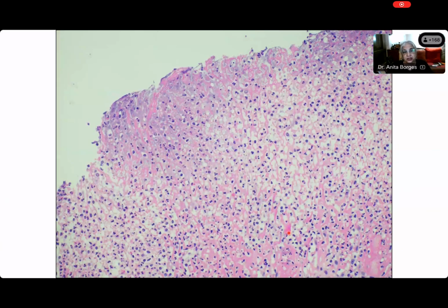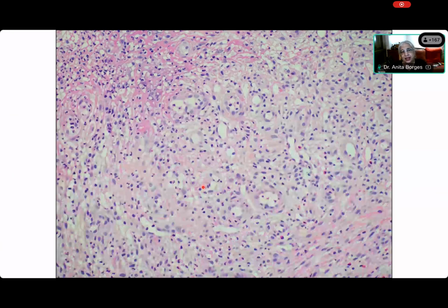Okay, so let's start from the top. You see this blue thing, and there are no spindle cells. Okay, you see the fibrin network in which the neutrophils are there, and you see this leaky stuff that is there, and now you see the base of this ulcer. And this base, which is the interface between the abnormal tissue and the normal tissue, for the first time, you are beginning to see spindle cells.